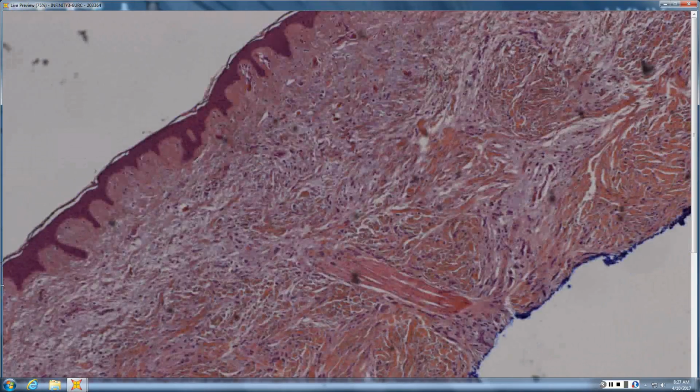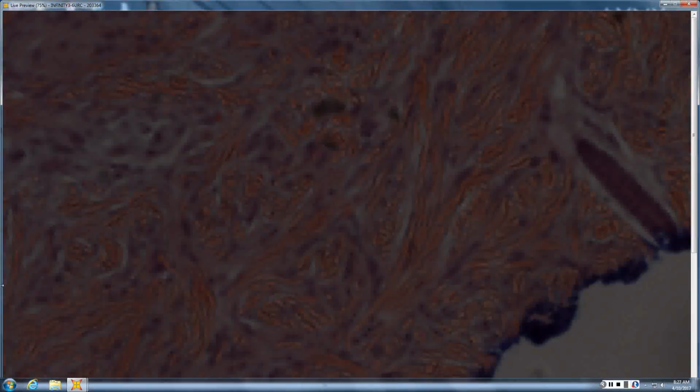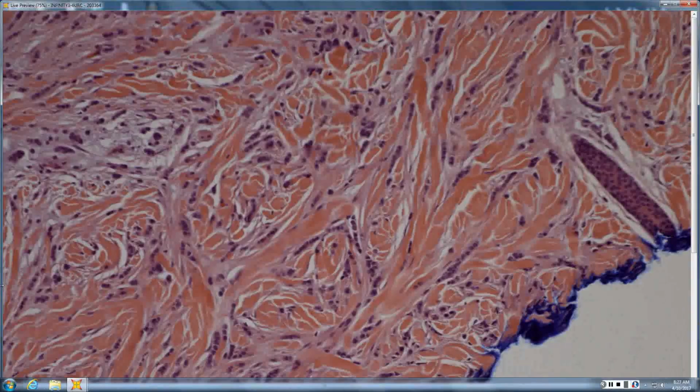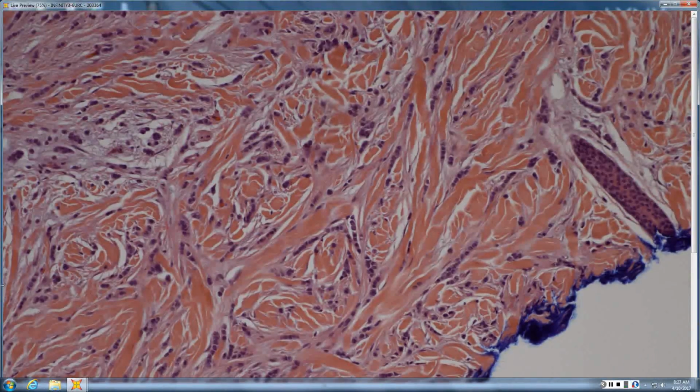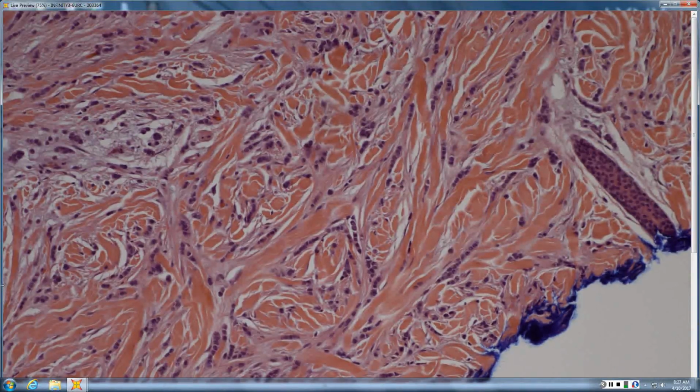So you sort of have loss of hair follicles, or at least scar there. I'm worried about like a metastatic Indian filing. Yep. Indian filing of cells with molding, so they look boxcar-like, which is usually what? Breast cancer? Breast. Correct. Well done.